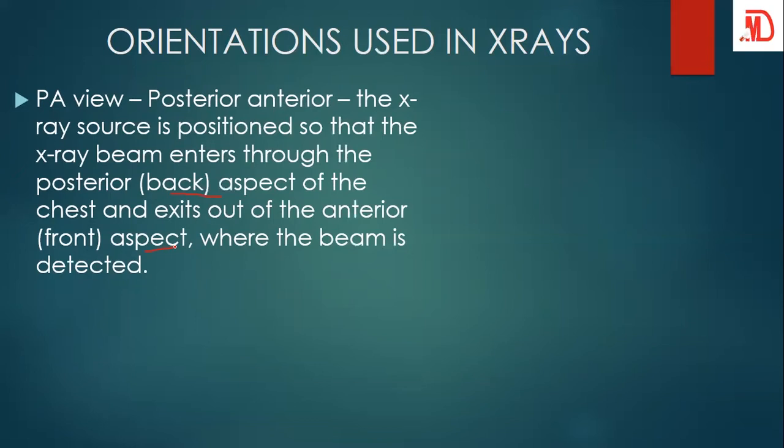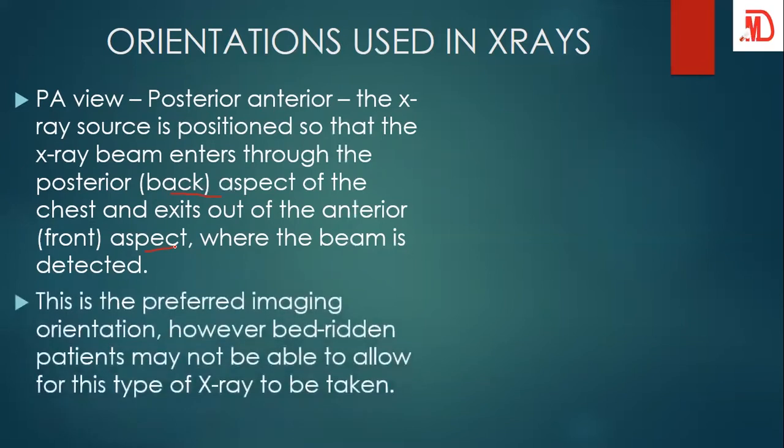Now, this is the preferred imaging orientation. This is the preferred. However, people who are bedridden will not be able to do this kind of x-ray for us. And that will take us to the next type of orientation called the AP view or the anterior posterior view.